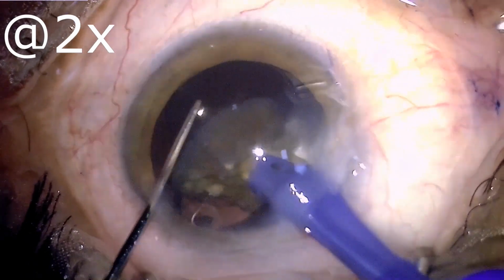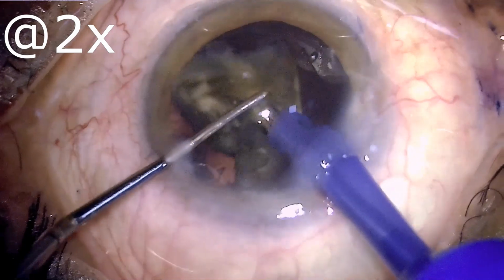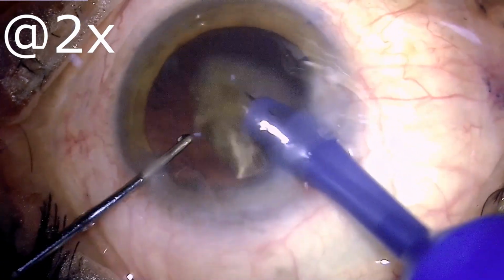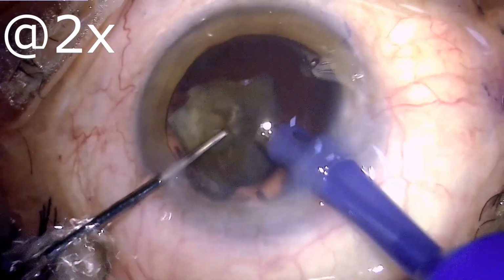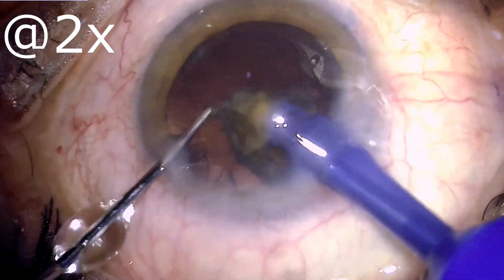Another important thing is to create more than 4 pieces so as to have chunks which are smaller and they don't protrude into the anterior chamber or come close to the corneal endothelium, if one wants to avoid post-operative corneal decompensation.